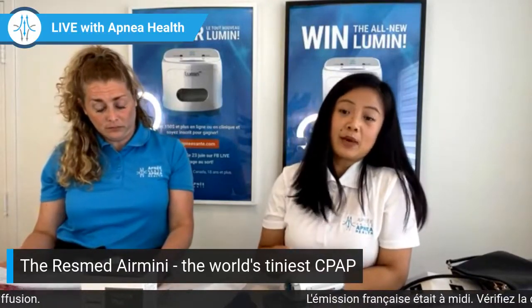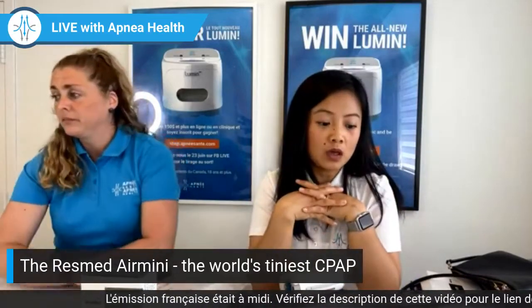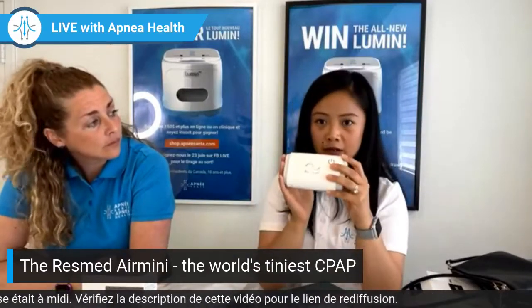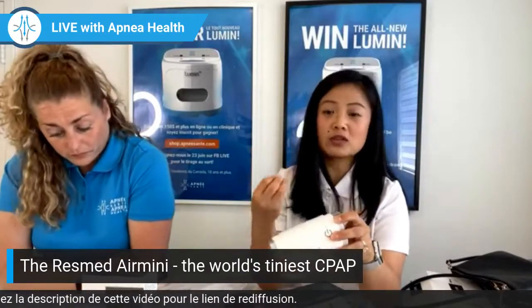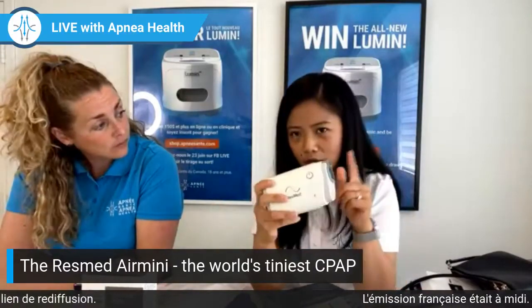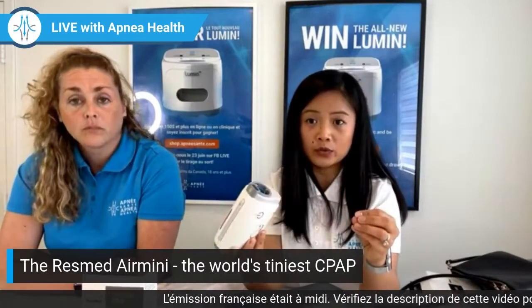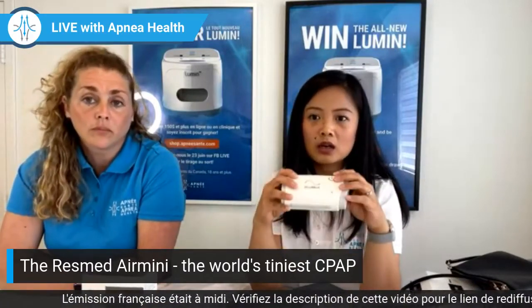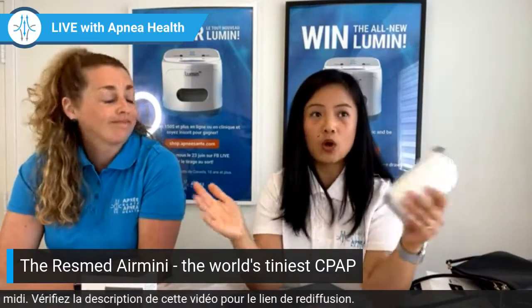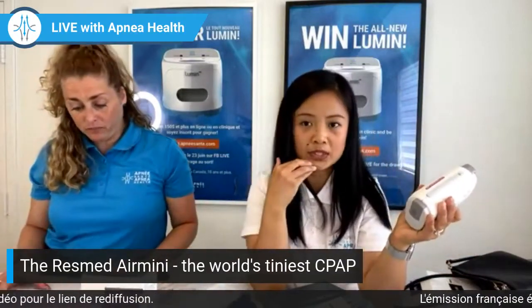If you're starting CPAP for the first time, that means you just got your diagnosis, the respirologist gives you a prescription, go get a CPAP. I would not recommend the Airmini for the very same reasons, its limitations. One, you only have 5 masks available for it. And for somebody starting CPAP for the first time, you want to open that window of being able to try all of the masks. Having more possibilities, more options.